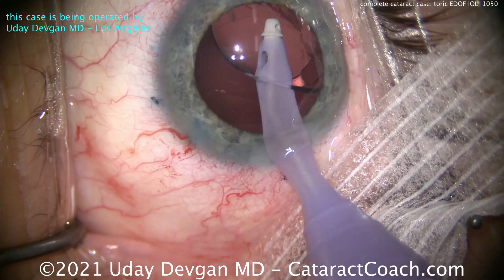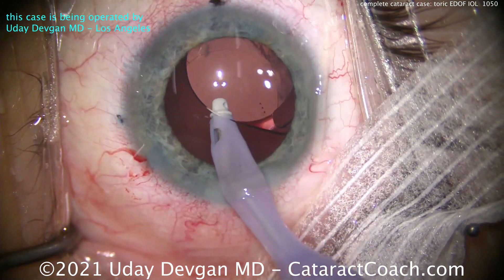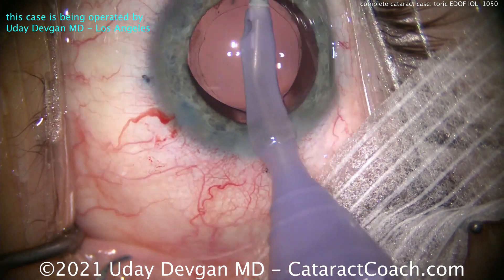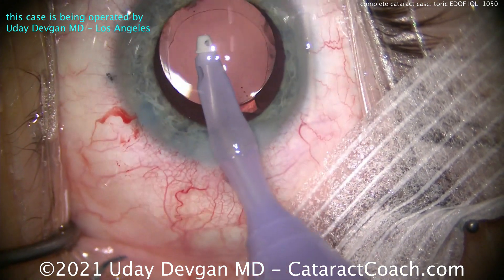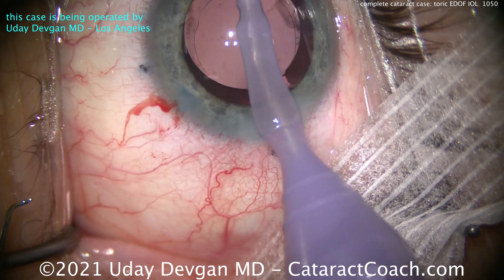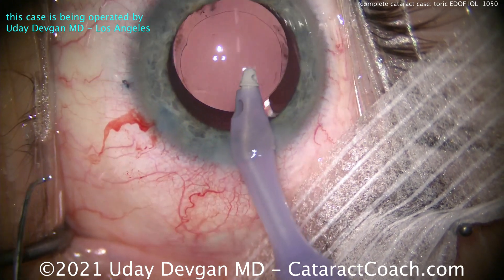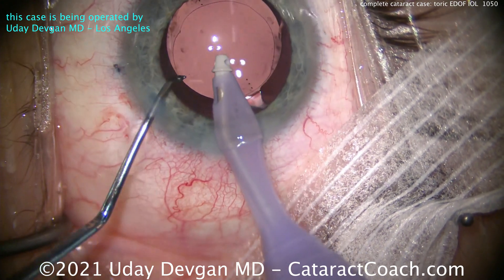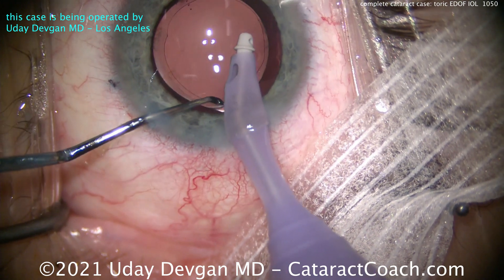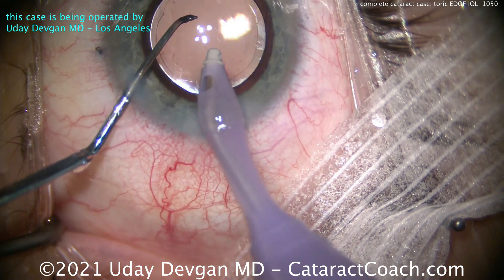We're cleaning out the capsular bag, really taking our time to make it as clean as possible. You can see the toric marks on the lens. We're going behind the optic — very important — you want this optic to directly touch the posterior capsule, with no viscoelastic layer in there. The lens needs to be centered with respect to the extended depth of focus central zone, and also in the correct meridian or rotational axis to line up the toricity for treatment of the astigmatism. Now we're nudging the lens slightly into the exact position we want.